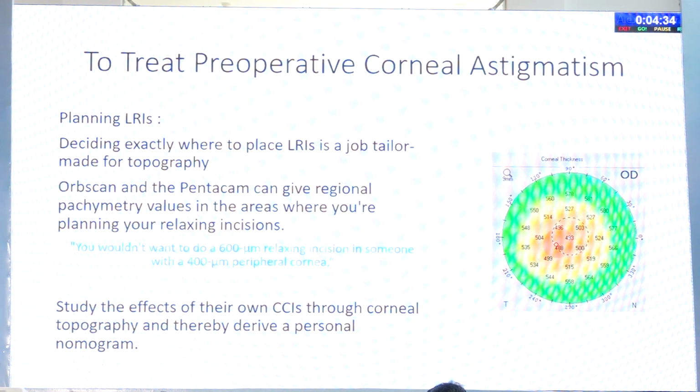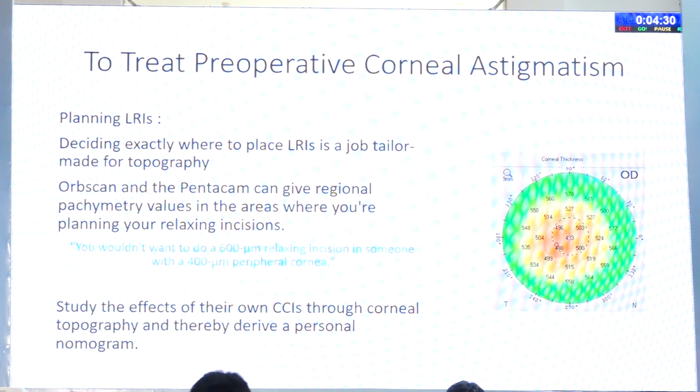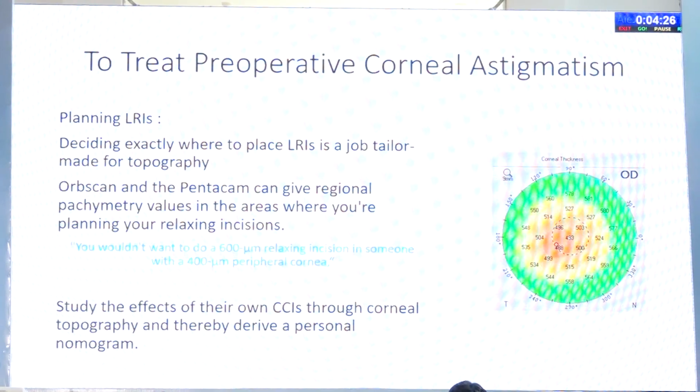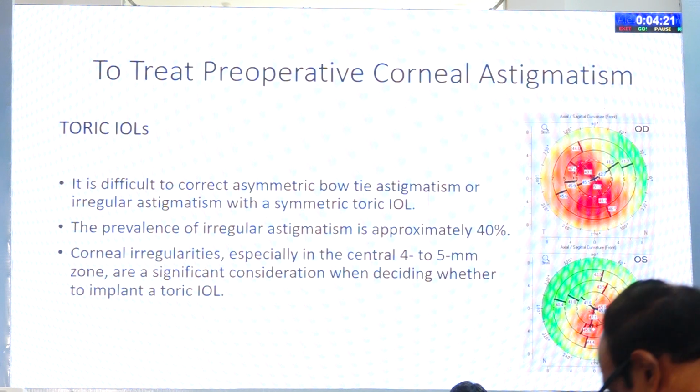And after doing a CCI, if you want to know how good the effect is on that particular cornea, you need to do the topography postoperatively. So you need to design your own nomogram when it comes to LRIs and CCIs.